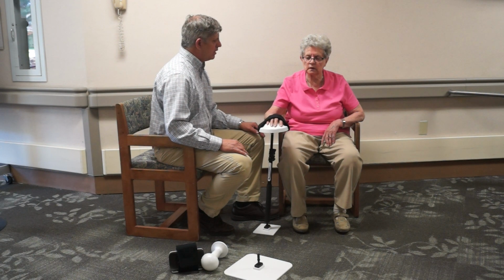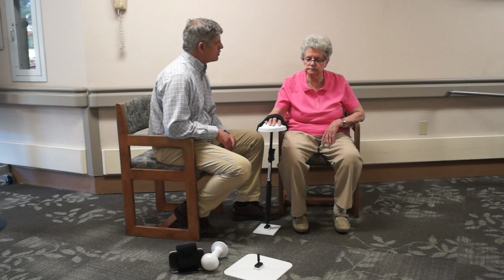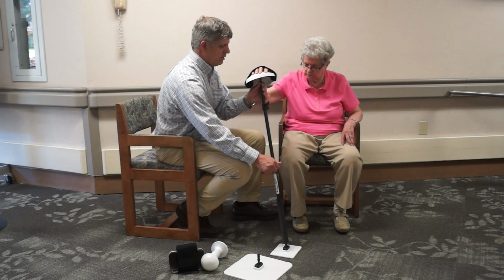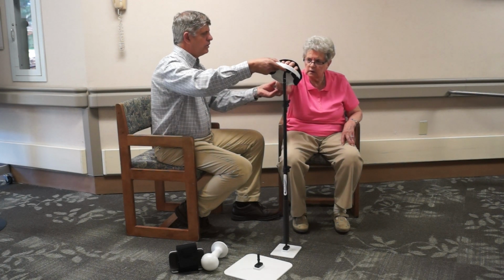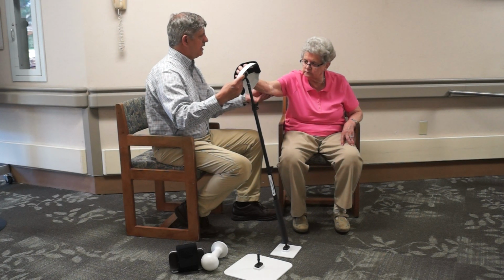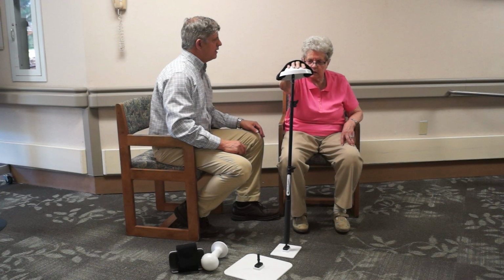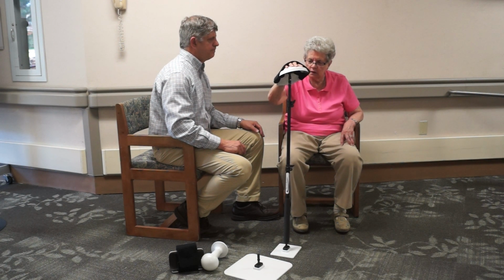The other one was a little bit more stable, but this gives you the opportunity to use your full strength. So let me bring it up a little higher for you, okay? So I give you a chance to do what you did before, where you can explore movement, okay? So you can act like you're going to go up here, and you could turn your forearm over, okay? Or you can go up here like that, okay? So just be creative, just explore, maybe like you're painting on that canvas, like you're reaching out to put paint on your canvas, okay?